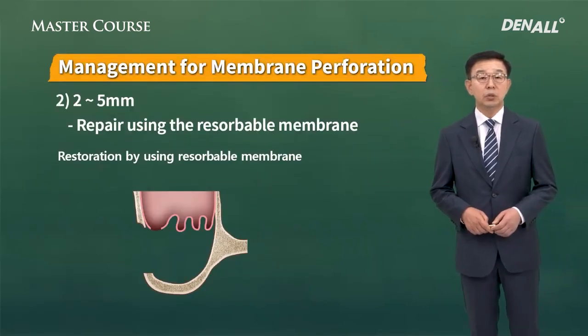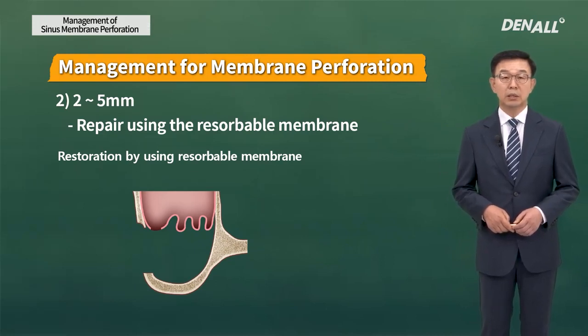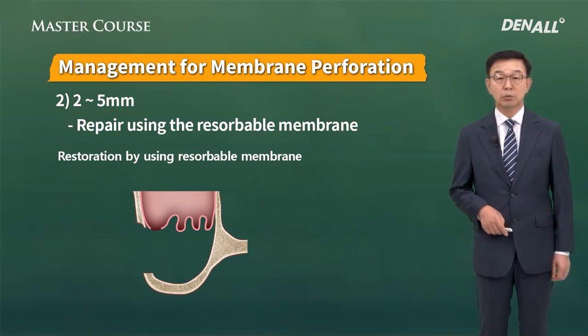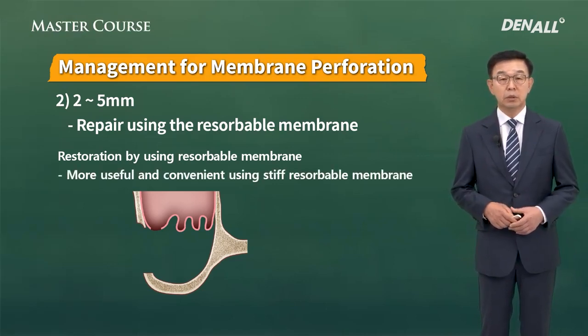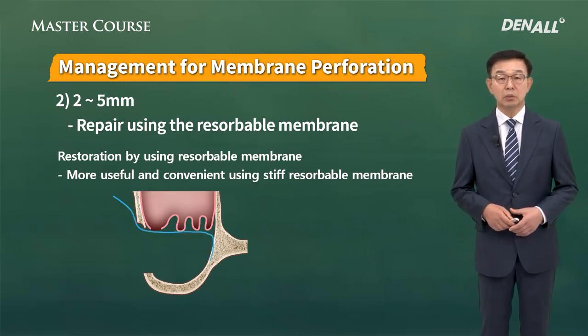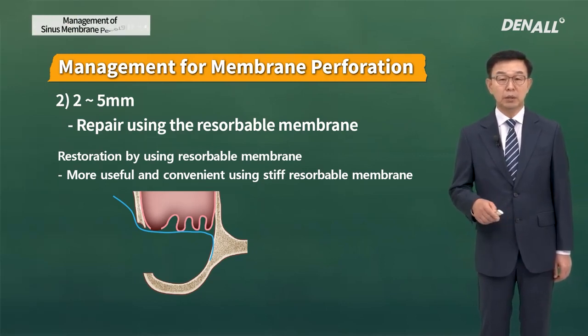Next, there's a case where the tear is about 2 to 5 mm. This is the most frequently experienced case clinically. You'll be able to restore easily using resorbable membrane in most cases. The resorbable membrane should be large so that it can extend beyond the torn area. And it is more favorable to use a stiff resorbable membrane. The resorbable membrane needs to cover an area beyond the torn area.